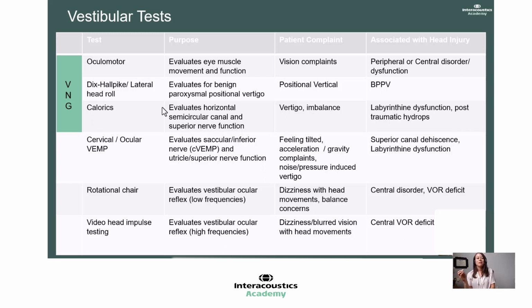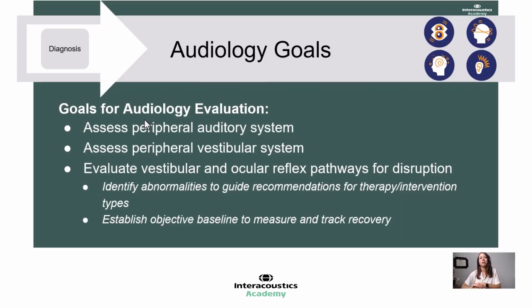So today, I want to just run you through, we're going to go through two main realms of an evaluation, a vestibular evaluation, the oculomotor aspect and the vestibular ocular reflex evaluation aspect. There's obviously many more tests we can do, and depending on the patient that you're seeing in the clinic, it may necessitate different tests. Not every patient is the same. But regardless of what tests you specifically do, when you see a patient post-head injury, you typically have some of the same goals maybe that I have.